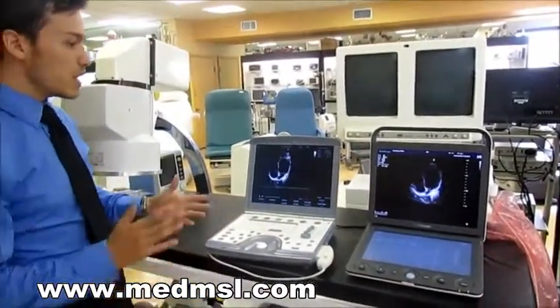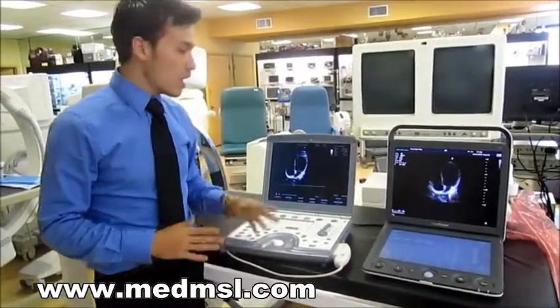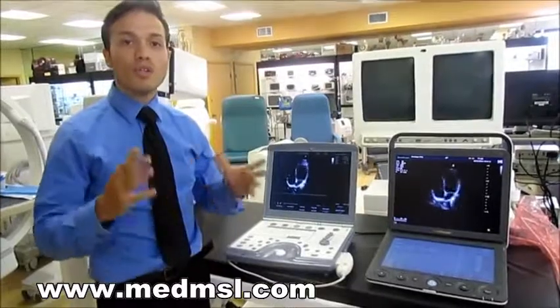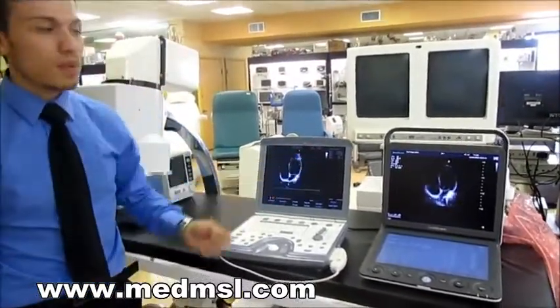Another thing to address is that a lot of people are scared to go with Chinese ultrasounds. You might be hesitant at first, but it's essentially the same exact technology — all they're doing is making it better. So let the quality speak for itself.